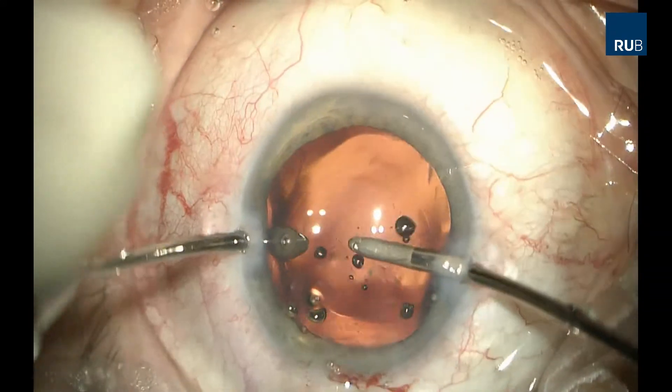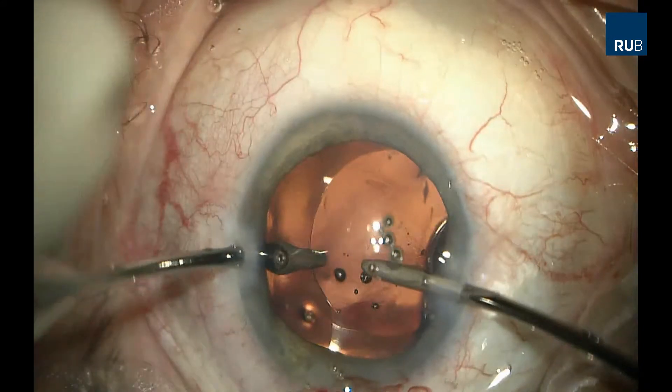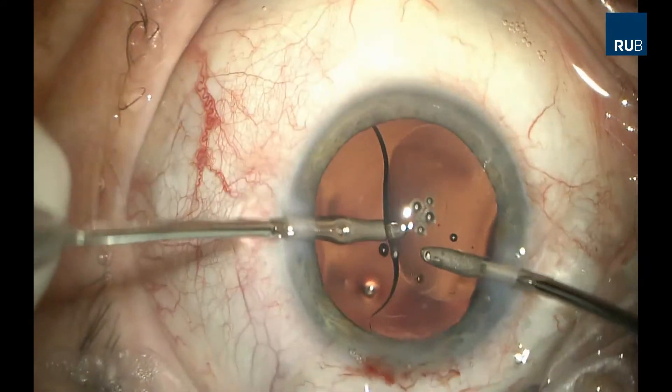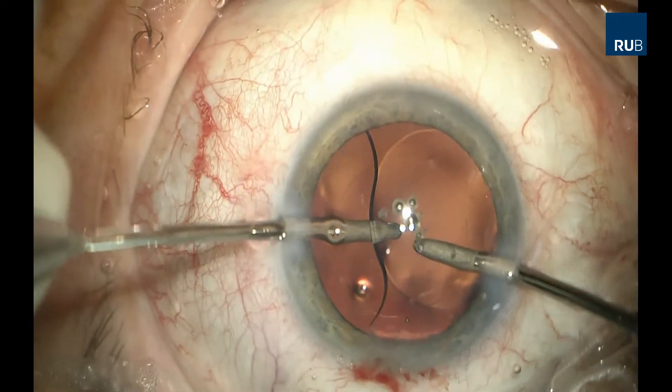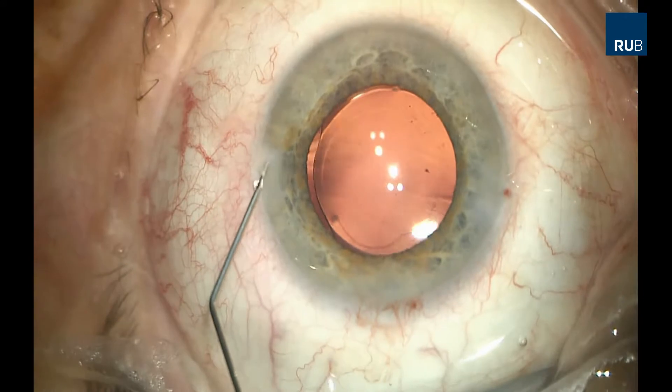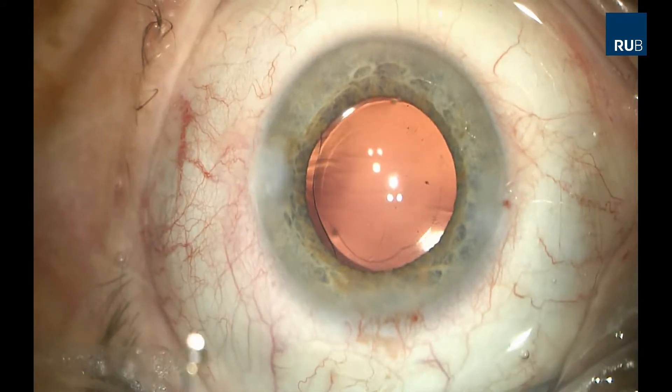A small amount of OVD is injected behind the IOL and the patient is docked to the laser system under sterile conditions.